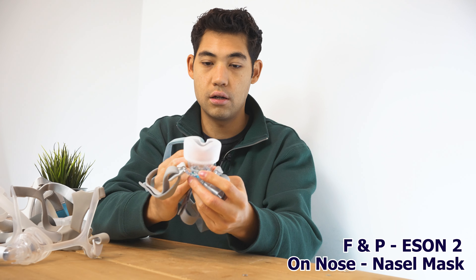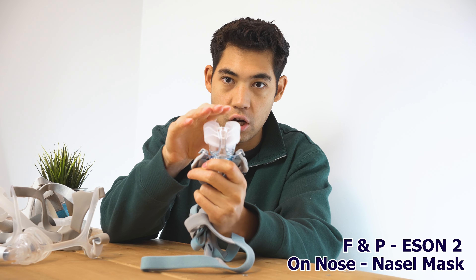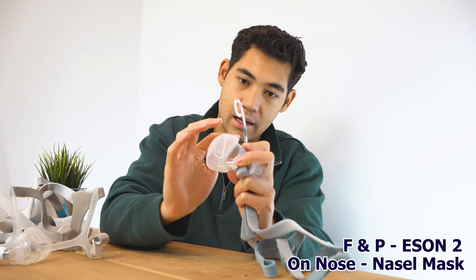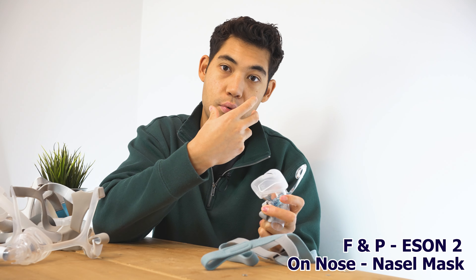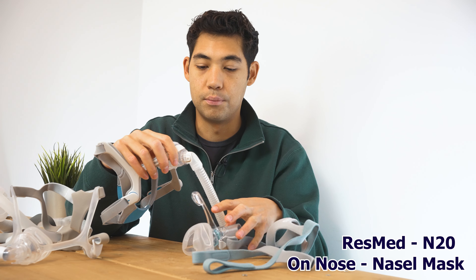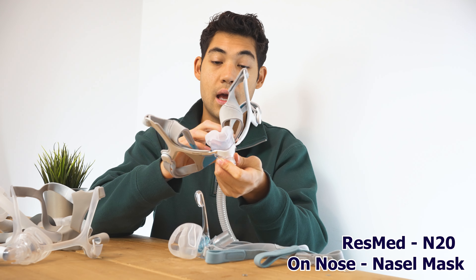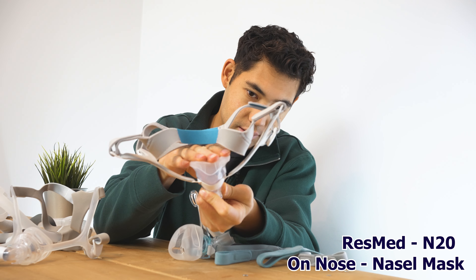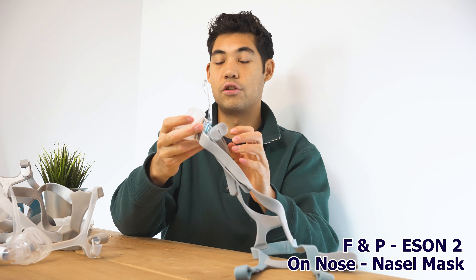Looking at the Eson 2 cushion — look how soft it is, look at the squish. There's an area that relieves pressure and folds over the hard part. Because I have a squishy nose, this mask actually doesn't put a lot of pressure on my nose. The N20 is still a great fitting mask for most people, but if you press the front of the N20 it's quite firm, whereas the Eson 2 has a lot of give. That's why I like the Eson 2 best.